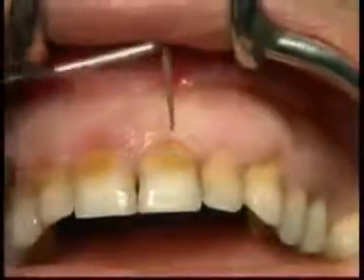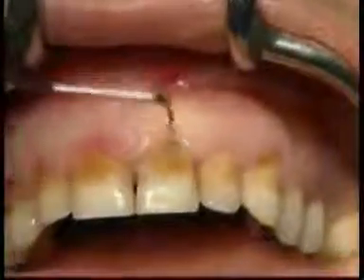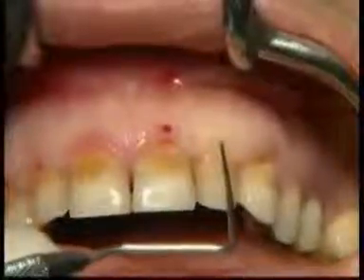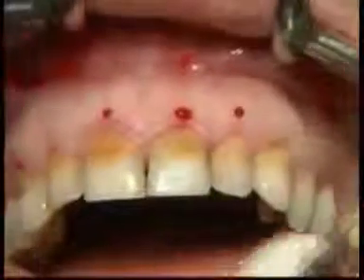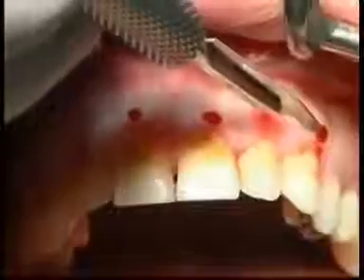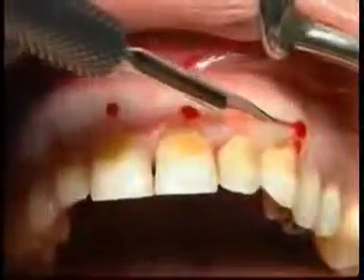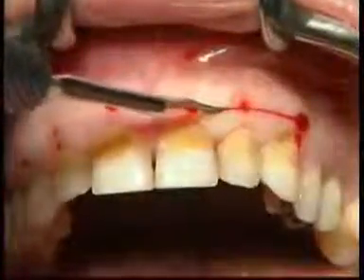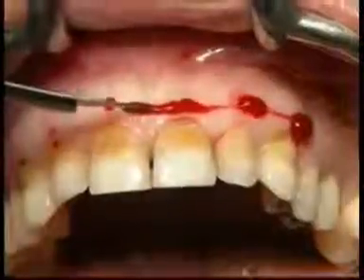The same procedure is repeated on each tooth for which a gingivectomy must be carried out. In this case, the pseudopockets are only present on the vestibular aspect. Once all the punctures have been made, a 15C blade is used to make a perpendicular incision which is not beveled and which will reach the vestibular aspect of all the reference points which are clearly visible.